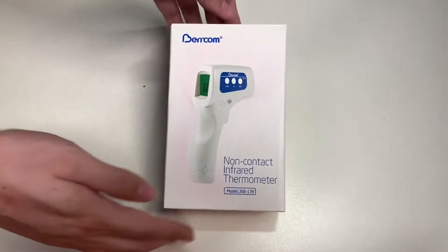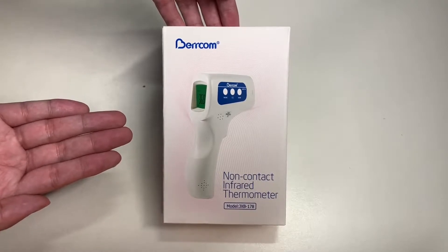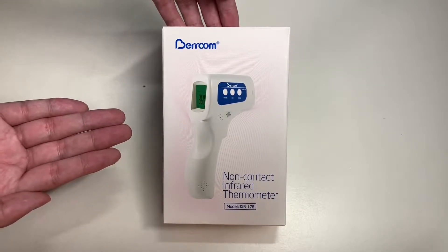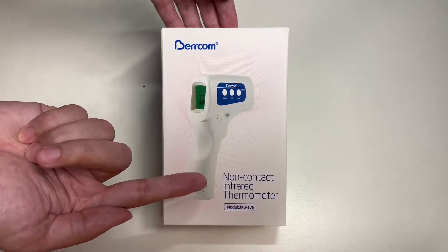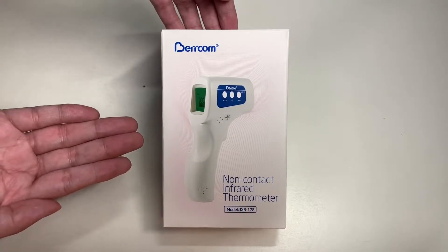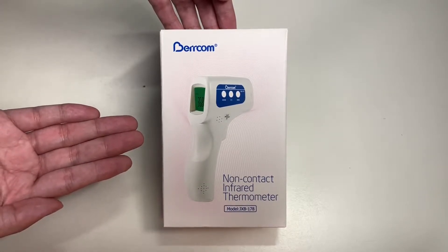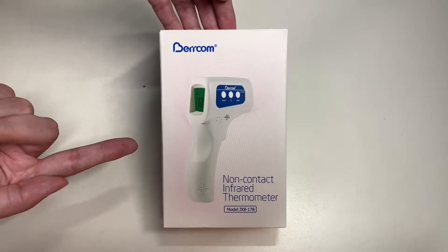Hello everyone, welcome to another episode of Unbox with Alex Trend. In this episode, we'll be unboxing the Berrcom non-contact infrared thermometer. You can get this from Staples for $34.99. Today we'll be unboxing this thing and checking this product out.